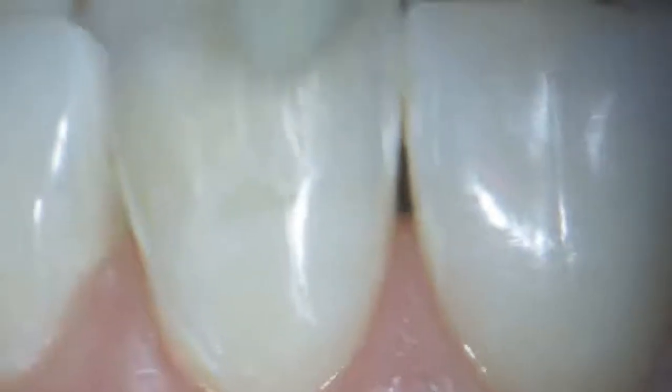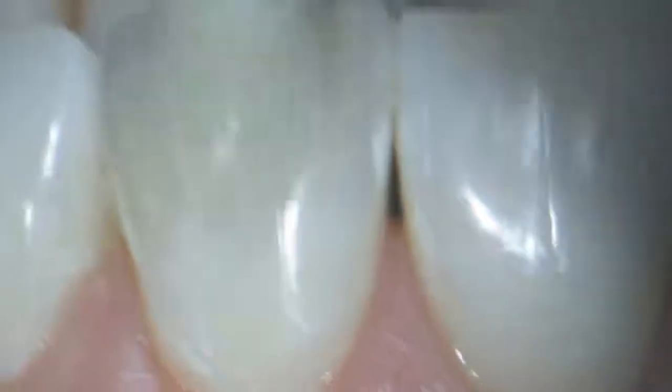The stage of polishing I start with Pogo polishers from Dentsply Sirona company.